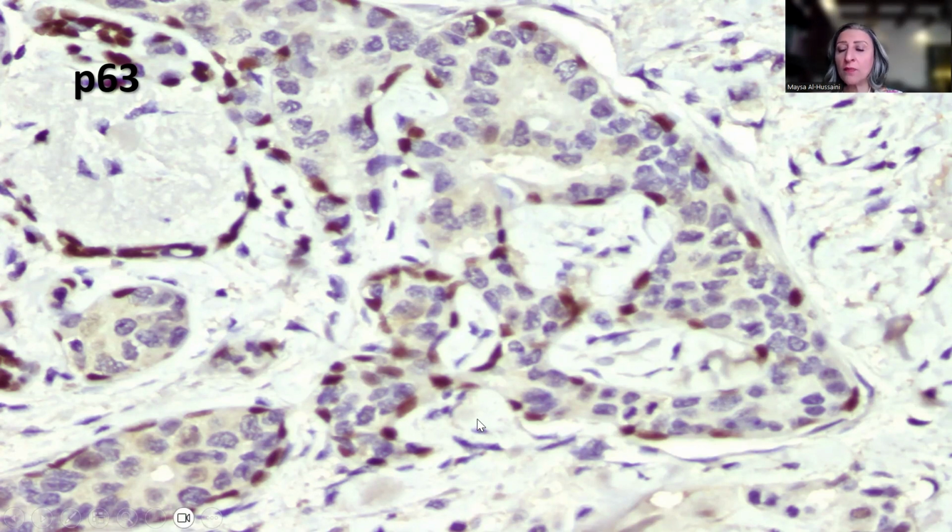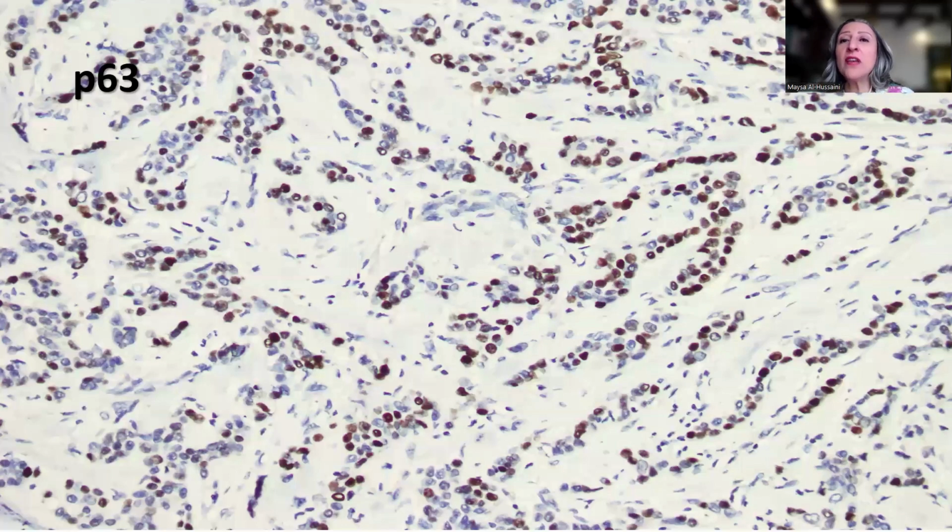Now, another very interesting potential pitfall that occurred in this tumor is the invasive component. As is well known for most practicing pathologists, P63 is a nuclear stain for myoepithelial cells. However, in a small minority of invasive ductal carcinoma, P63 can be positive in the malignant invasive cells. So these are the malignant glands actually, and they also stain with P63.